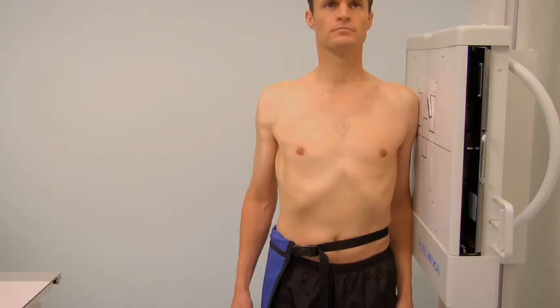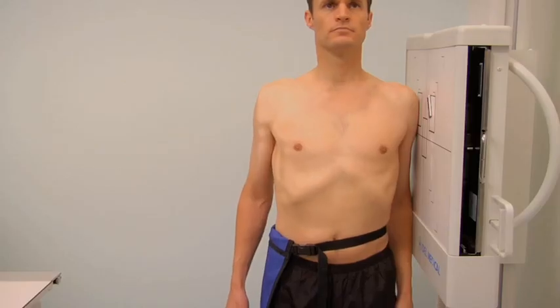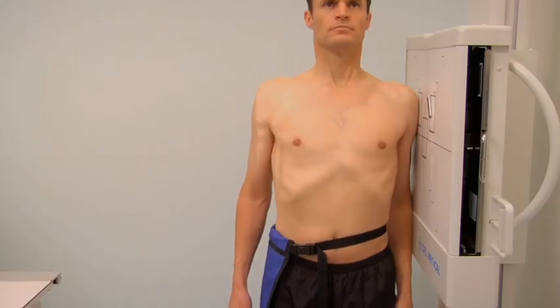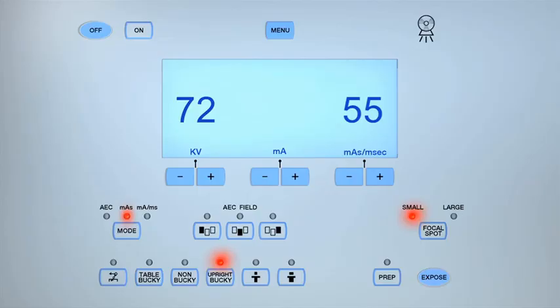Ask the patient to breathe in and hold. Prepare and expose the cassette. Review the images for both projections.